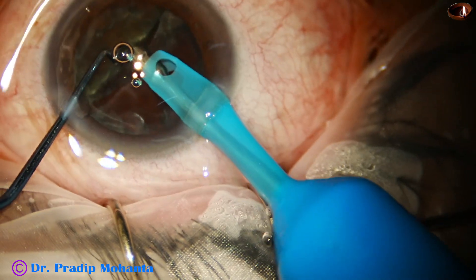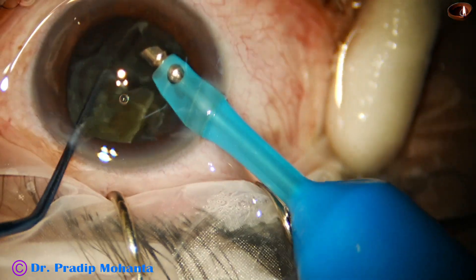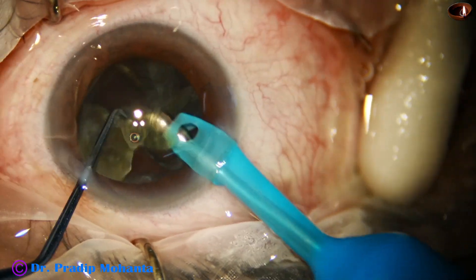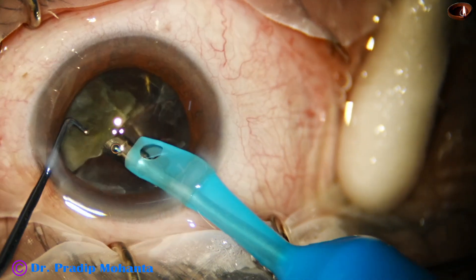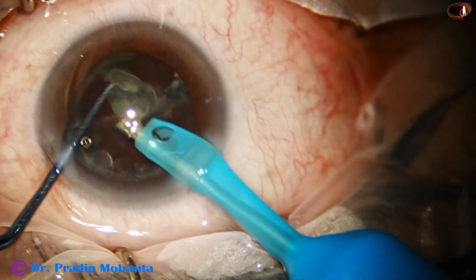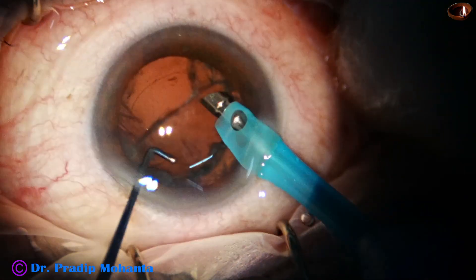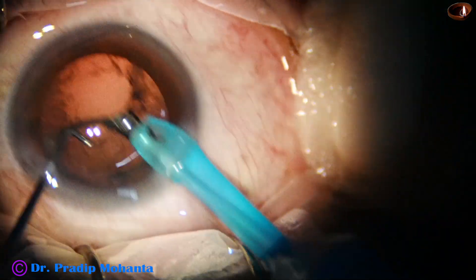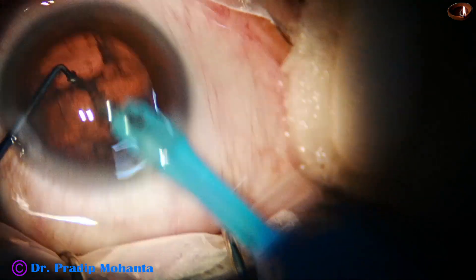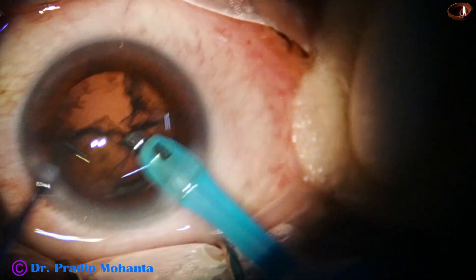The other hemi-nucleus, which has not been divided, is divided now in this way. We just have to learn how to hook the equator with the nucleus sustainer. It is a round-bodied and ball-tipped instrument, and it is very safe. I am struggling to remove this epinuclear shell — mobilizing with the nucleus sustainer, and ultimately, I could mobilize it.